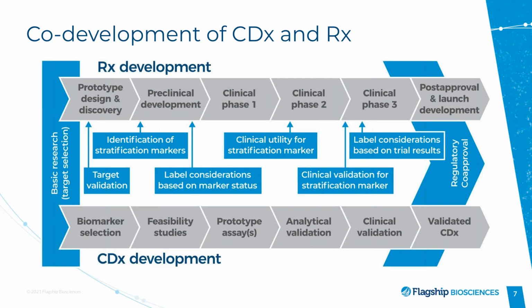And for us, we were testing a variety of different hypotheses. So, we wanted to make sure we had what we thought was a solid assay, but didn't have to be done to the rigor that you need later on during your clinical development. Really think of it as a research use only assay. So, we did some internal validation, got this assay up and running, and our next step was actually moving into testing some clinical samples. And this was basically going to be a retrospective analysis from tumor samples that we'd already collected during a phase 1 trial. So once again, really trying to parallel our clinical development of our drug.